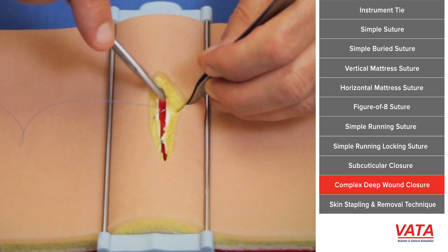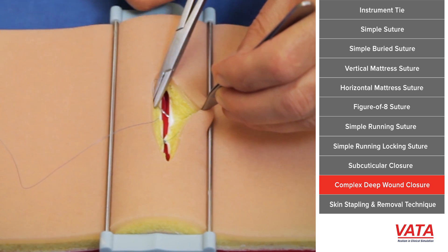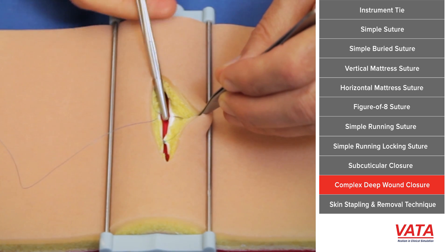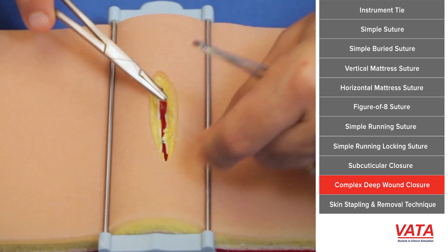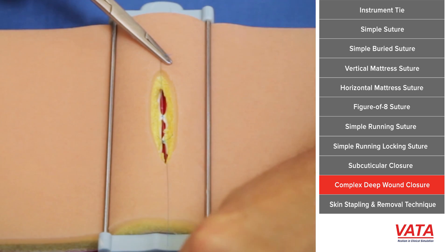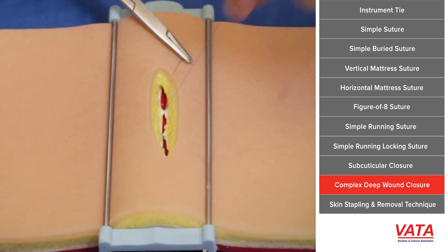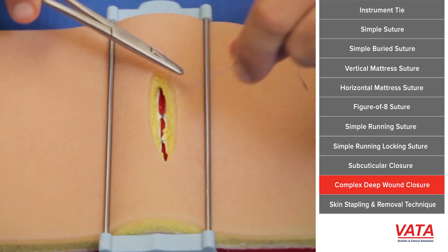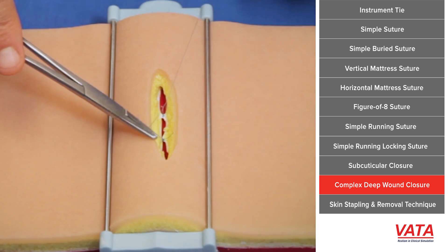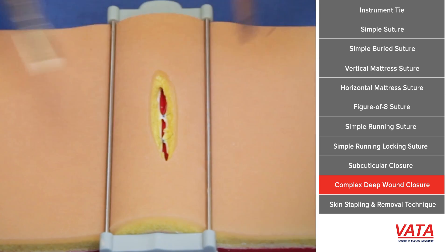We're going to put a couple of interrupted simple stitches here to close the fascia. You sort of put a stitch in, see what it does, put a stitch in, see what it does — that's the way we do it in surgery. Sometimes you need a lot of stitches, sometimes you don't. Stitches are a foreign body, so if you're worried about infection, you'd use an absorbable suture so it's not going to hang around. Remember you can always throw an extra throw — like three throws — or you can just lock it down by pulling on it.